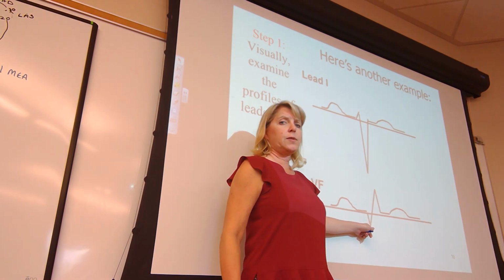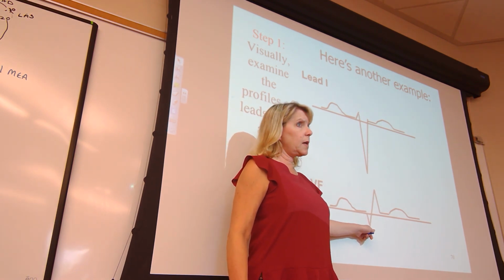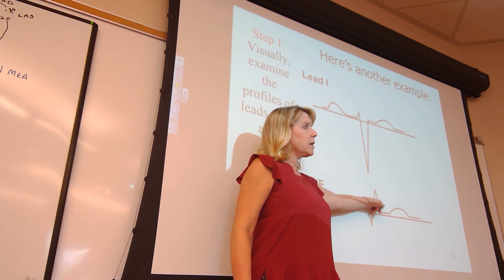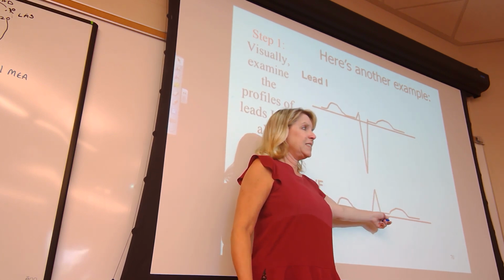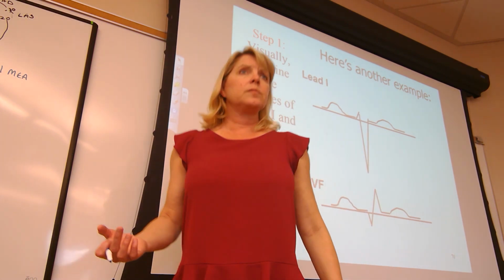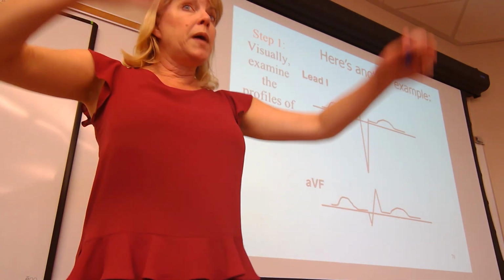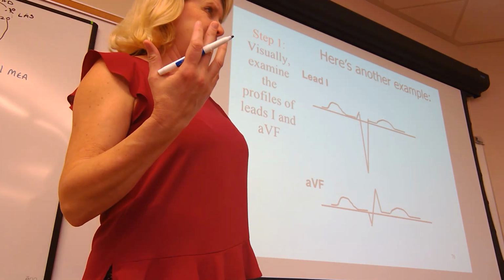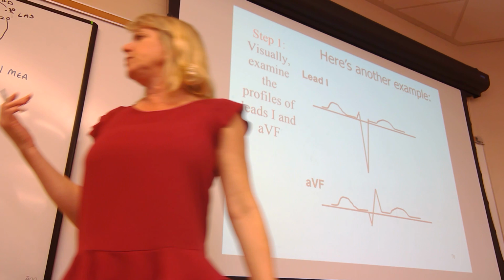Do you look at this? No, because that's Q, isn't it? Here's your R. Is there an S? Not really. So overall, is this positive? Robustly positive or ish? Ish. So how do you do that?